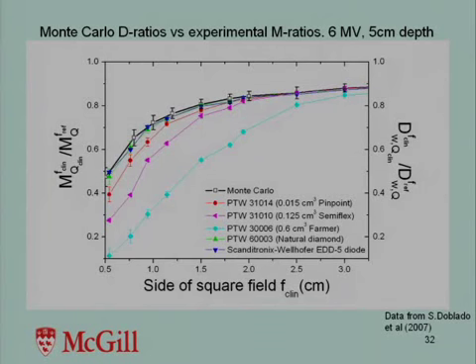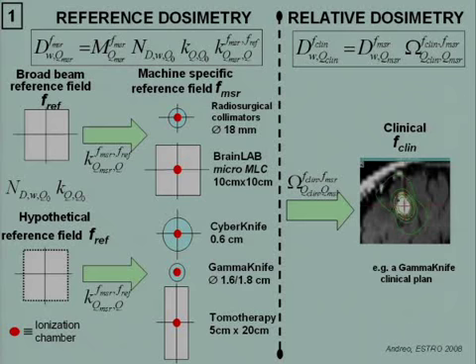And you see on this graph that, depending on the chamber type or the detector type, compared to Monte Carlo dose ratios, the output factor corrections can be significant. And there's all sorts of things involved in that, such as relative source size compared to the detector size and other things. Detector type, of course, details of the detector geometry and so on. You can consult this material in the summer school book or in the Alfonso paper in Medical Physics published early this year.